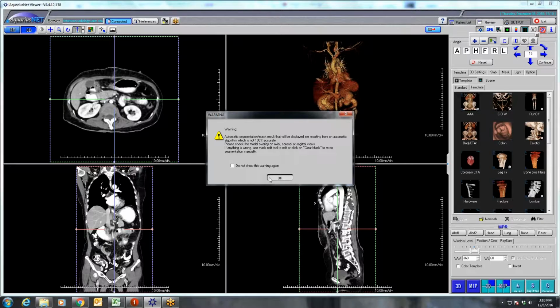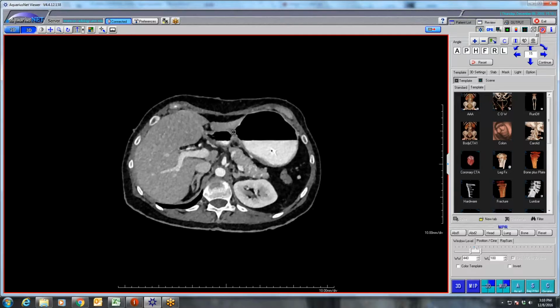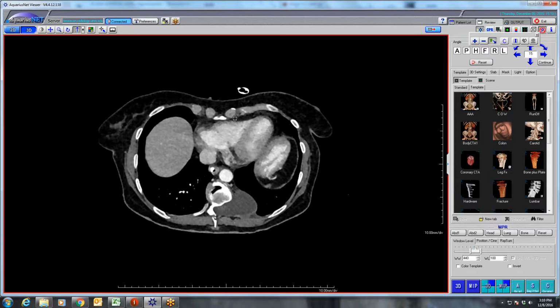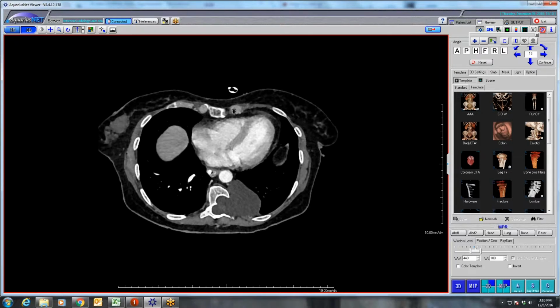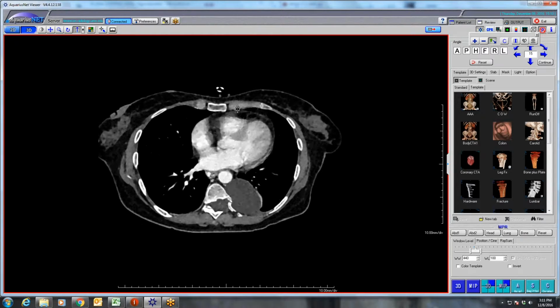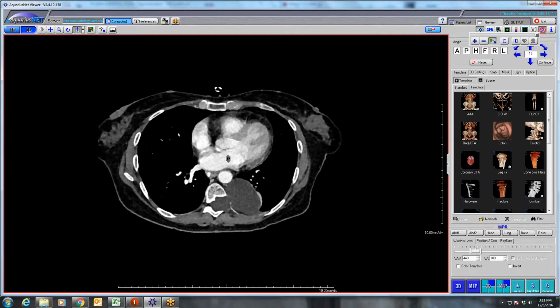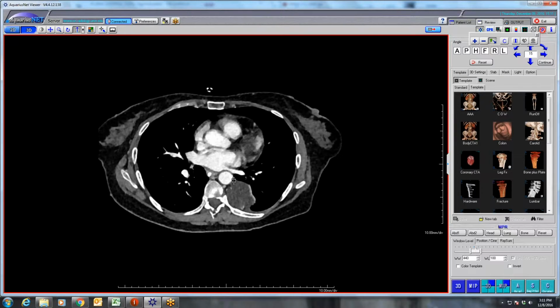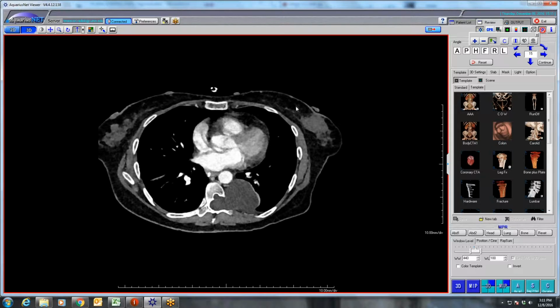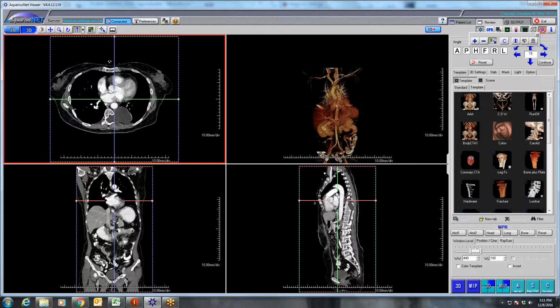And then this was a case we had a couple of weeks ago. I've only seen this one other time, and that case was nowhere near as pretty. So this is a woman with large, multiple lateral thoracic meningoceles. You see widening of the canal and widening of the neural foramina. You can see the skin lesions up here. This patient does have neurofibromatosis, and that is associated with lateral thoracic meningoceles.